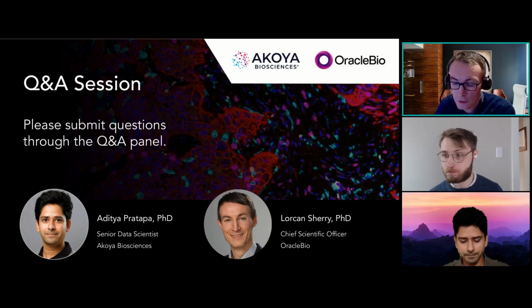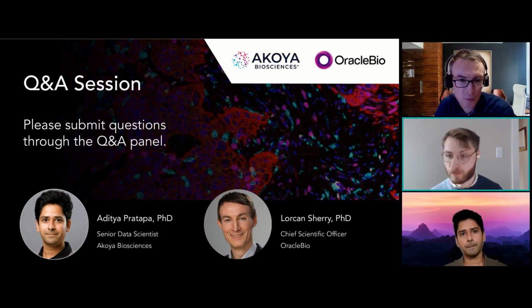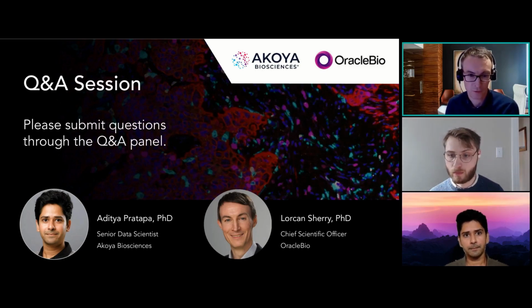Great. So in my presentation, I demonstrated the use of AI in the cell segmentation process and also the tissue segmentation process. And certainly in that area, we've seen some great improvements in how we are segmenting tissues and cells in the step before the thresholding. If we look at the early part of the workflow, at the image QC part, at the moment that's traditionally done by manual visual review, and that can be quite time consuming.